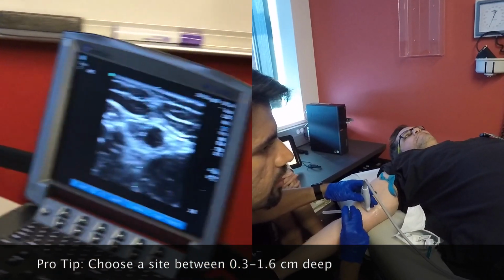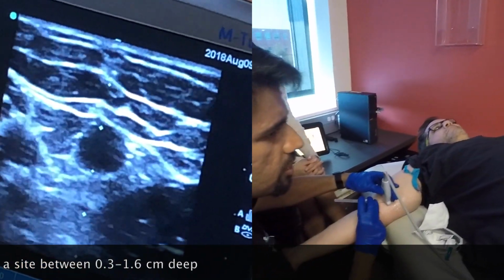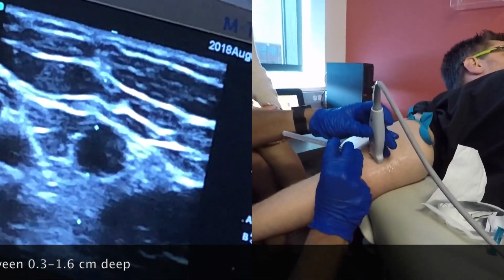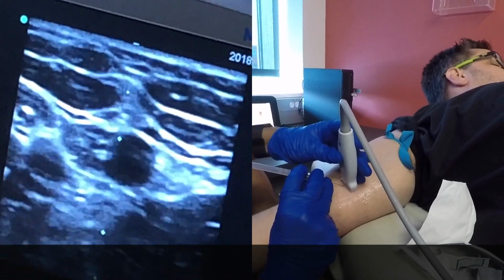So there's needle in the skin. So now what you do is once you're just somewhat in the skin, you move the needle a little bit. You see it right there? Right there in the subcutaneous tissue. We're now advancing. Try bouncing it and see what that looks like.